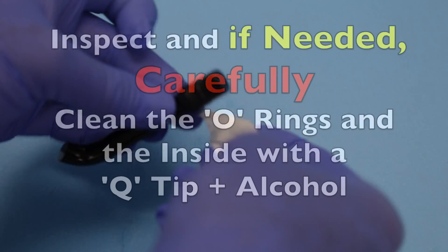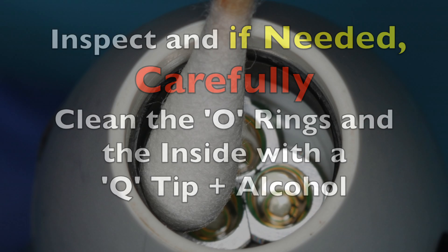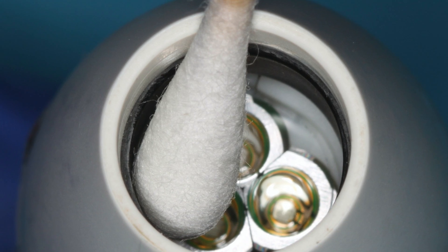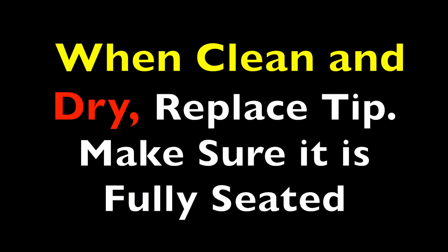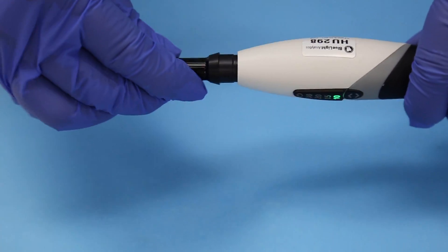If needed, carefully clean the area around the O-rings. Try and avoid touching the actual LEDs. And then when everything is clean and dry, carefully put the light guide back onto the curing light. Make sure you hear it click and make sure it's gone down all the way.